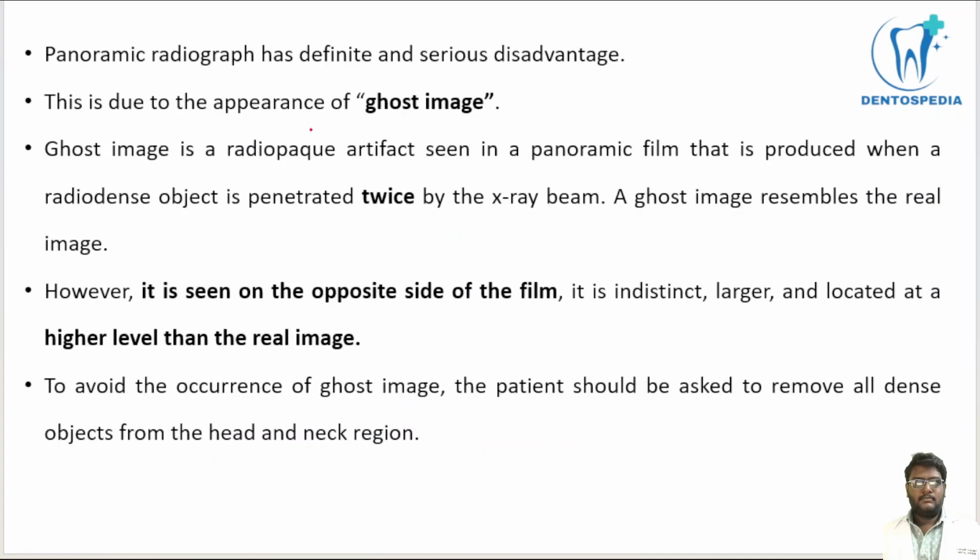Okay, panoramic radiograph has definite and serious disadvantages. As every technique has its own advantages and disadvantages, this panoramic radiograph technique has its own disadvantages. The first and foremost complication, or we can say disadvantage, is the presence of ghost images.